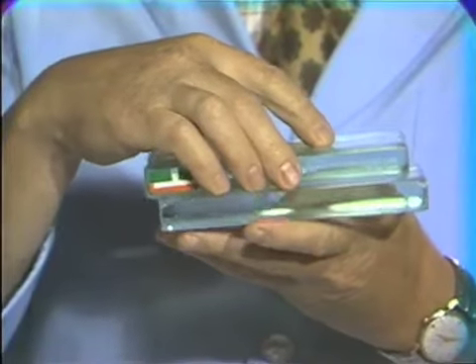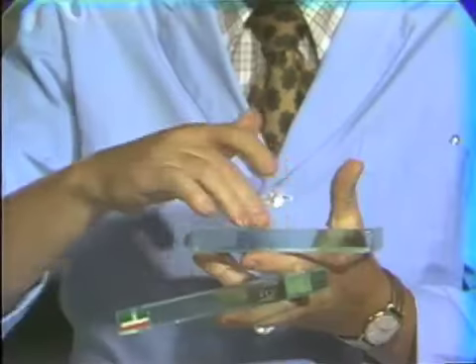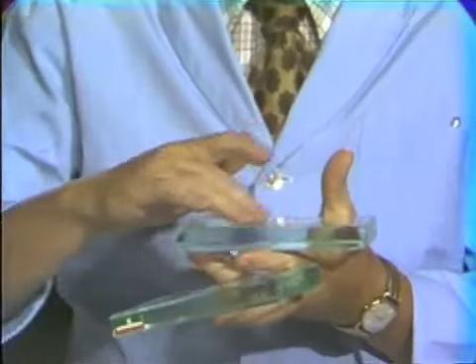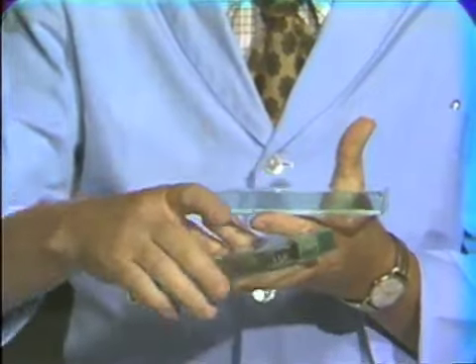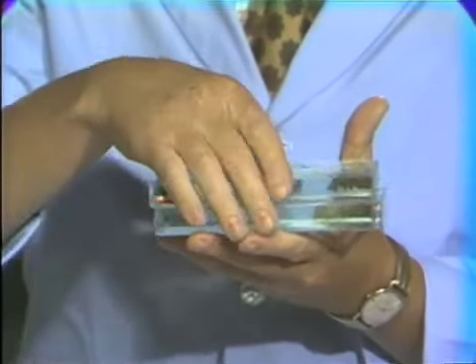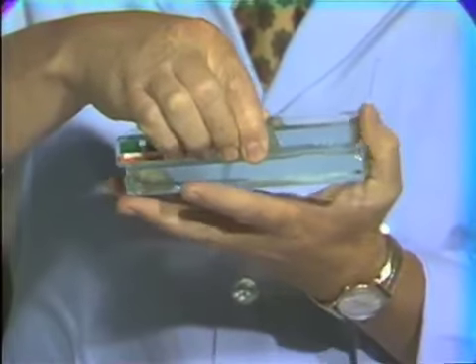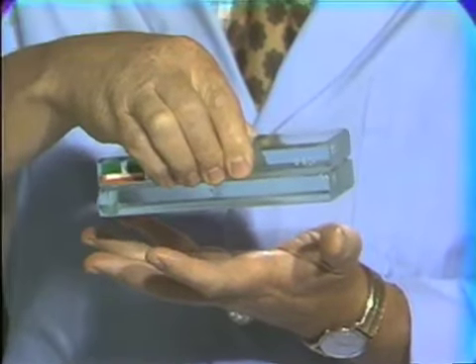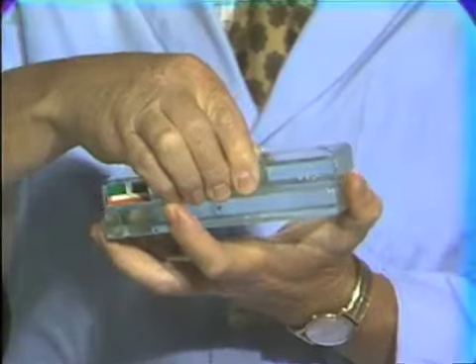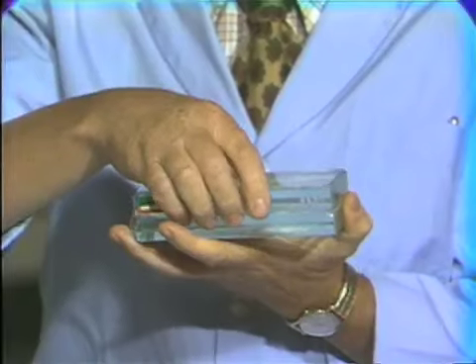So we would like a thin film of fluid between these plates. If we put a thin film of fluid, just put a couple drops of water on this plate, representing what we've done in the mouth, give us a semi-dried condition, we will see that we have a lot of retention. We can lift that lower slab with that thin film of fluid. So therefore, we do not want to dry the mouth out completely. We want to have a semi-dried condition. Then we have our maximum. I can't pull the plates apart without a lot of force. So this is the purpose of the semi-dried condition.